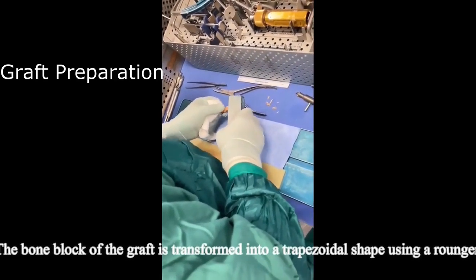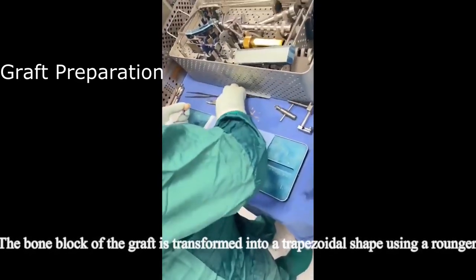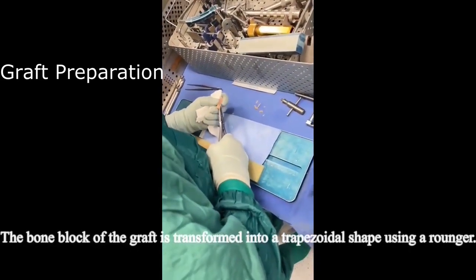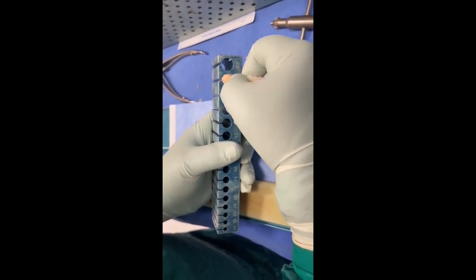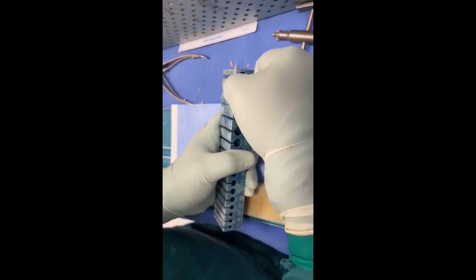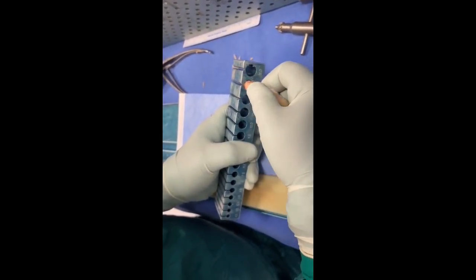The bone block of the graft is transformed into a trapezoidal shape using a rongeur. The bone block is shaped with a base width of 11.5 to 12 mm and a tendinous part of 8 mm.